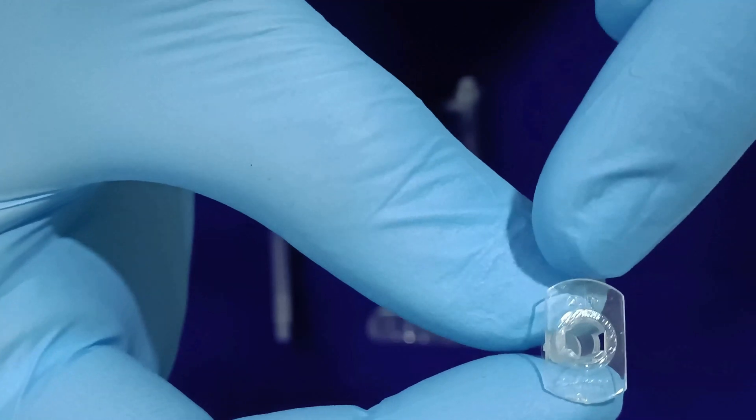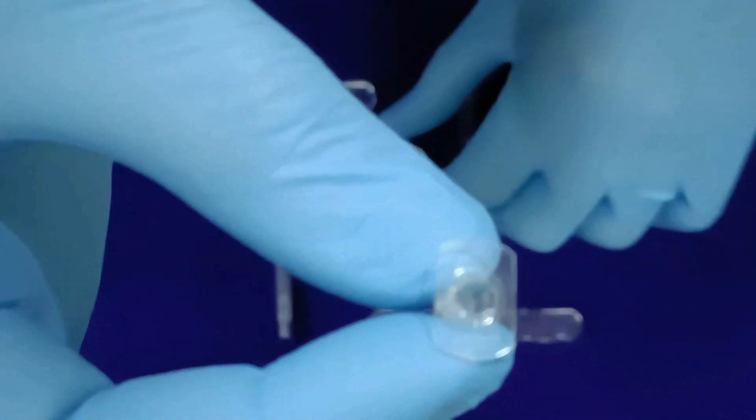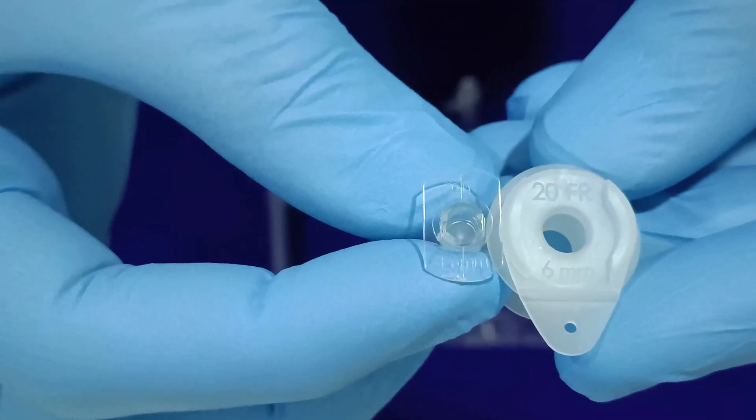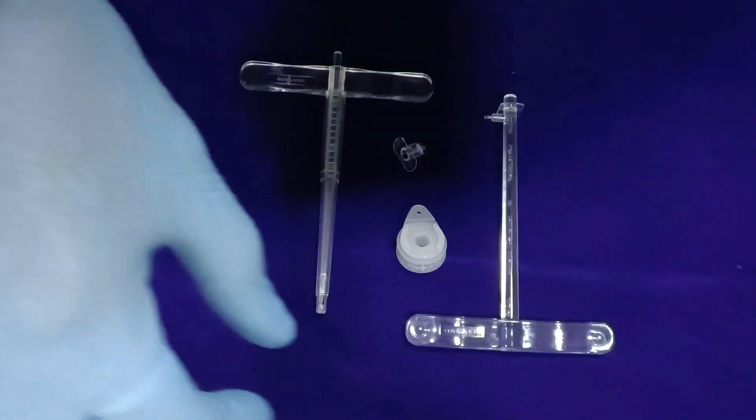The synchronization of FR marking on the inner and outer cannula is of utmost importance for ensuring correct placement. Both cannulas need to be aligned on top during insertion.